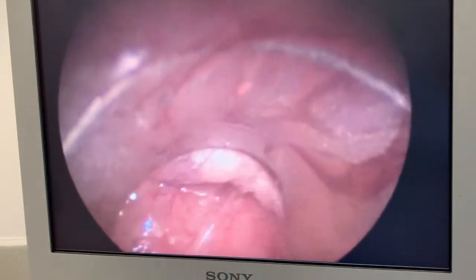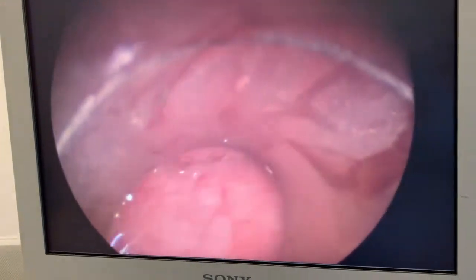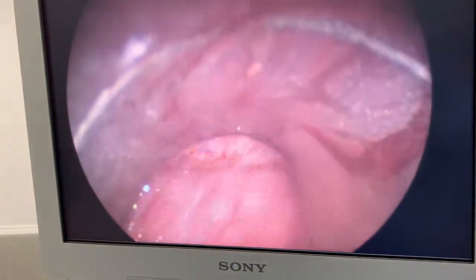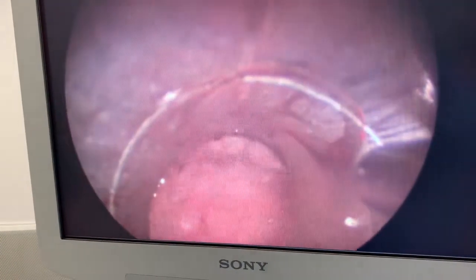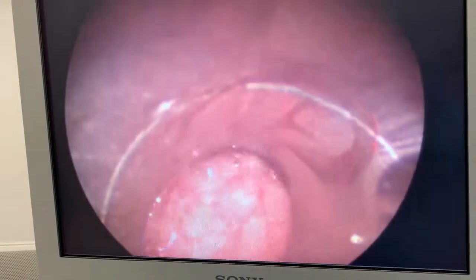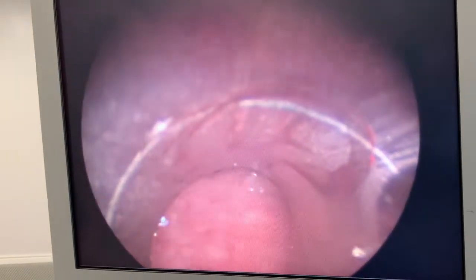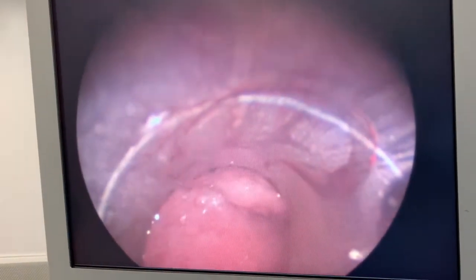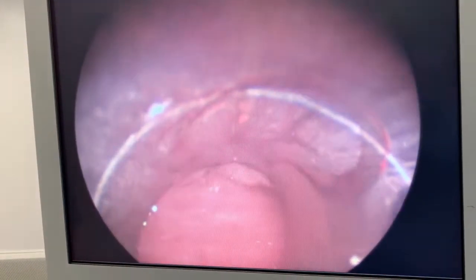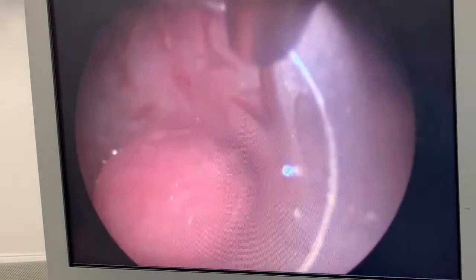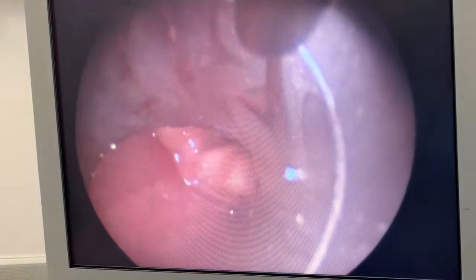This shows the rigid bronchoscope entering the mouth, pushing the tongue up as the bronchoscope advances along. We're just trying to find the epiglottis — and there you can see the epiglottis just on the left hand side.